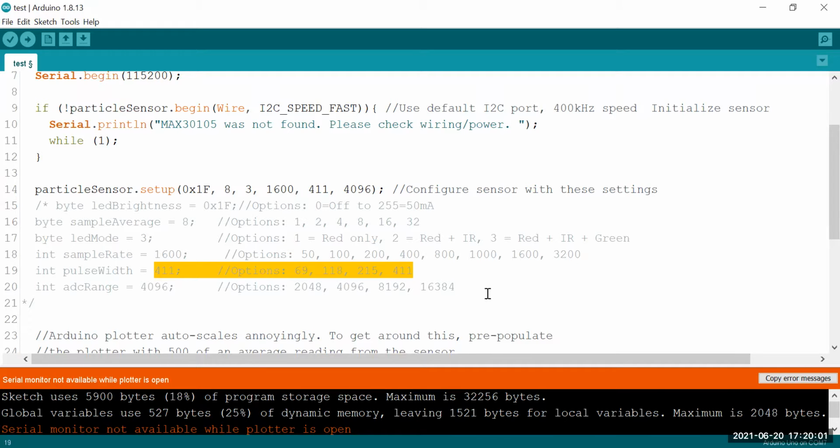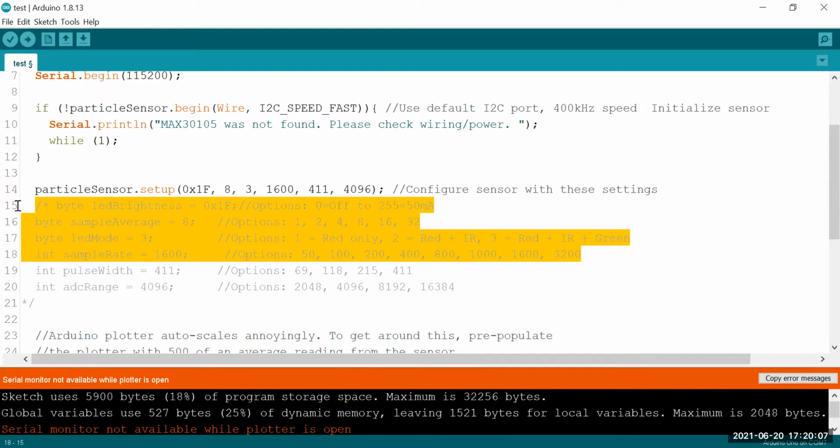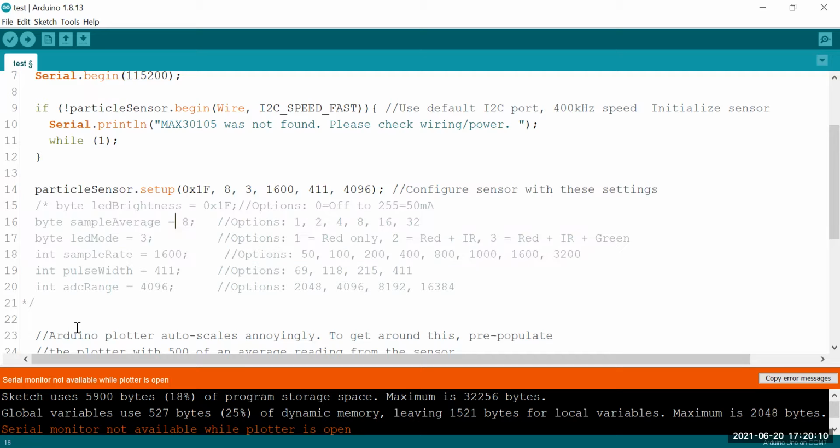I'll be honest, I don't actually know what these last two things mean. Maybe you can look it up on your own. But hopefully these parts help out. I have played around with the sample rate some. I like the faster. Played around with the brightness.